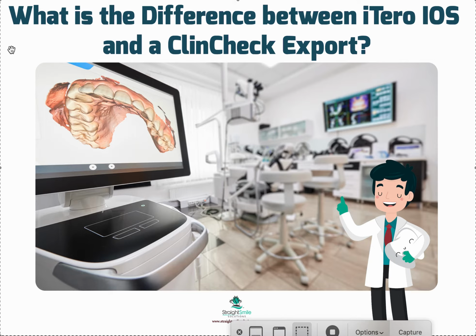It'll also show you how many attachments you need, where the attachments are. It'll also show you if you need interproximal reduction and where it'll be and how much. It'll show you if you need rubber bands and how you'll wear them, how many rubber bands you'll need, how many aligners you'll need, and lots of information.